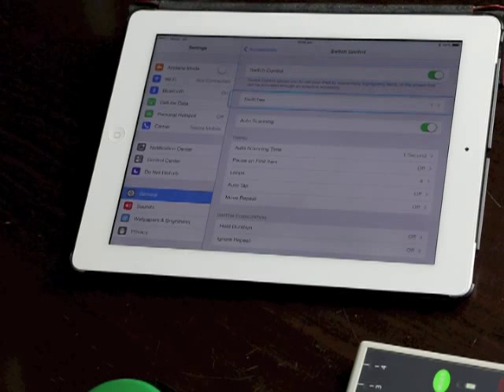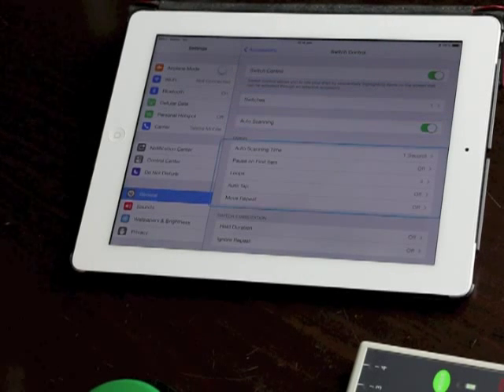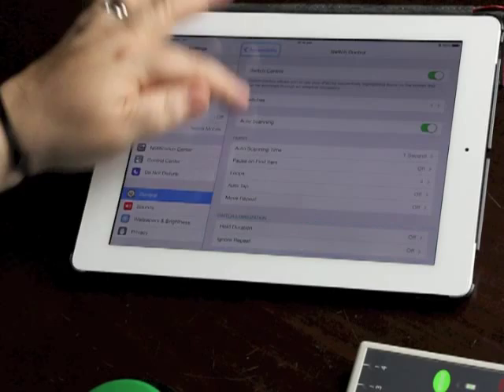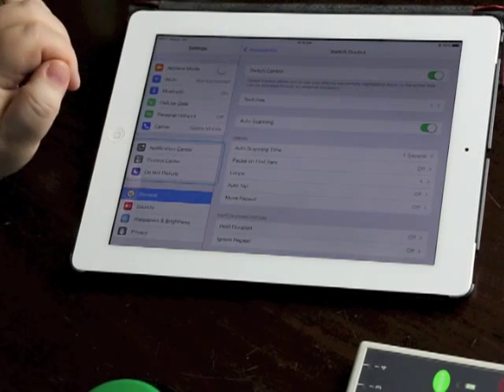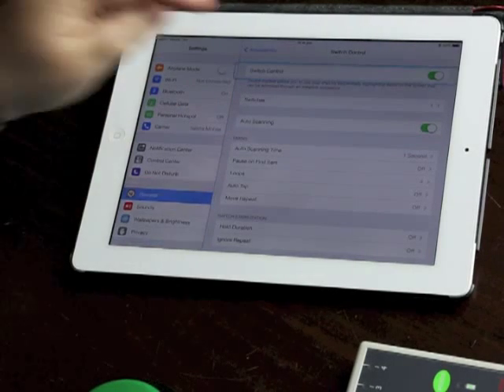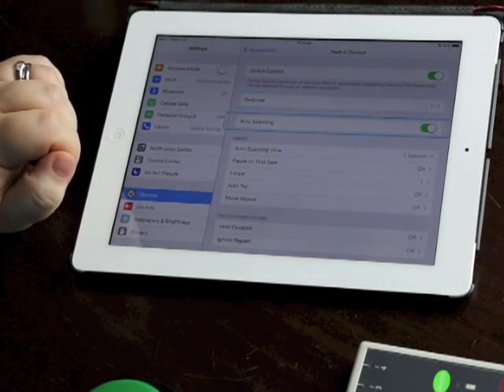We're back in settings which is where I want to be because I want to show you some of the scanning settings. So if we keep going down this menu, switch control is the absolute function so we turn it on or off with that green slider.